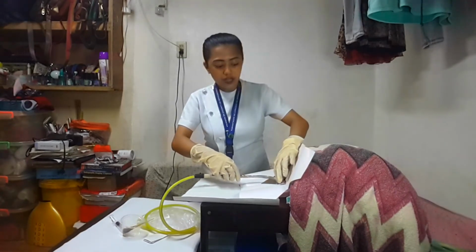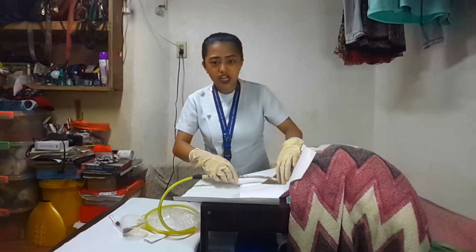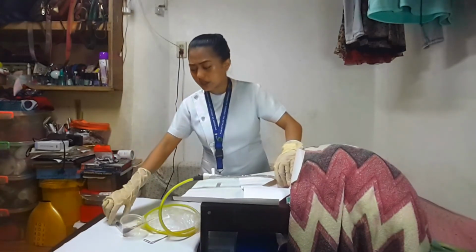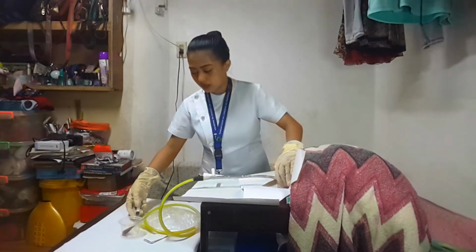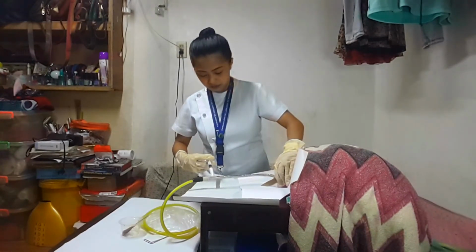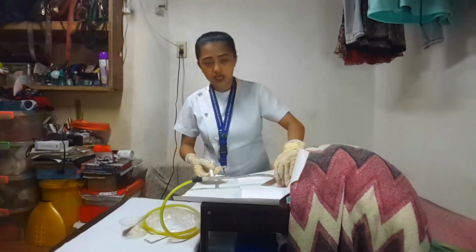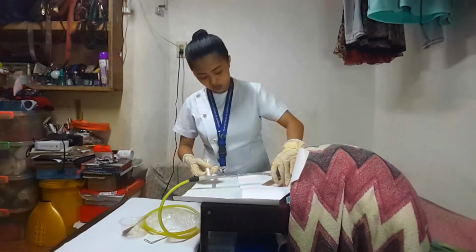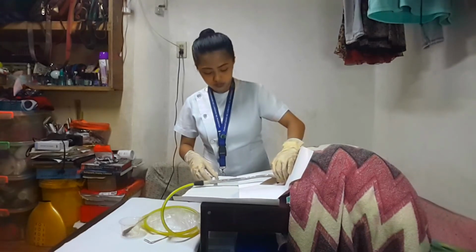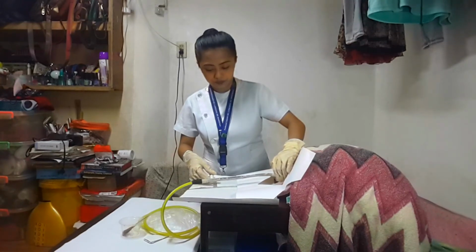Right. So, after that, we need to hold the catheter using our non-dominant hand so that it will stay in place, and then inflate the retention balloon with its designated volume. Alright. So, after that, we need to check if the balloon is now anchored by pulling it gently. Right. So, if we notice the resistance, okay, it is now anchored correctly.